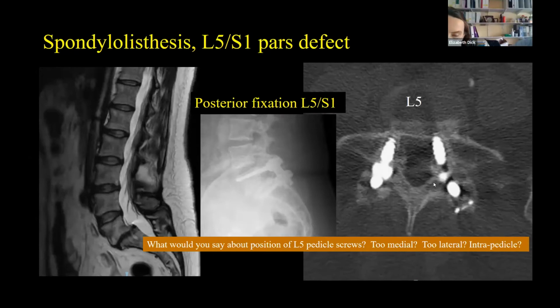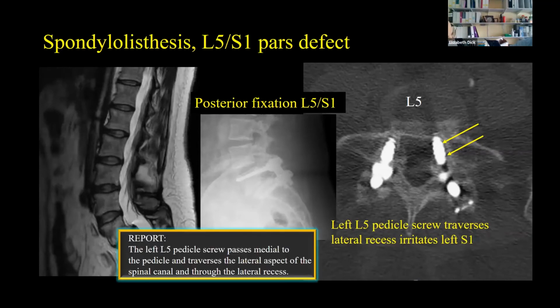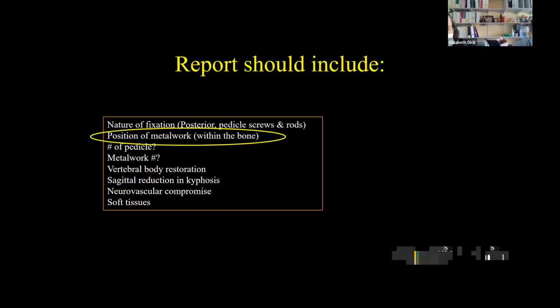So Yaron and Marcella both think they're too medial. Yeah, exactly right. So this screw here is definitely too medial. It's crossing the lateral recess, and so it's very, very likely that it's rotating or traversing the left S1 nerve root. So probably that screw has to come out, correct? Yes, that patient woke up immediately with symptoms and then they proceeded with a CT scan. So already the clinician and the patient are both concerned. That would have to be a straight revision of screw fixation to allow the patient the best chance of getting the symptoms to resolve. Okay, good.